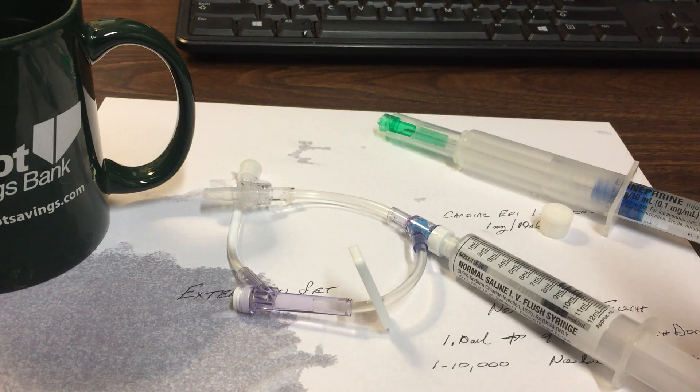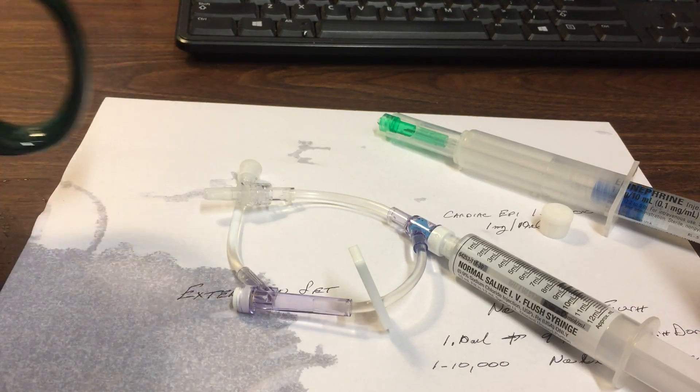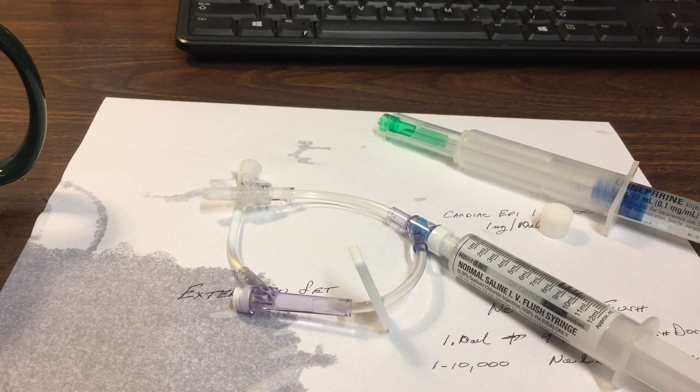It's a good idea to practice this. I just keep drawing out water out of this coffee cup and squirting it in there. In the heat of battle, when you're bouncing around the back of an ambulance, knowing what to do and how to do it is a good thing. I hope you find this helpful. Thanks.